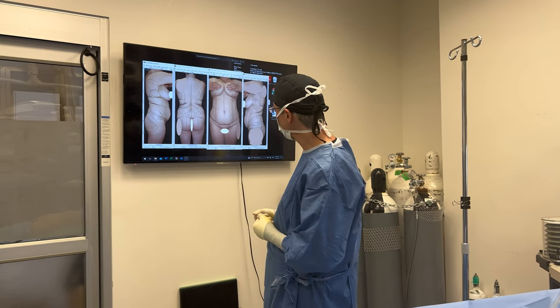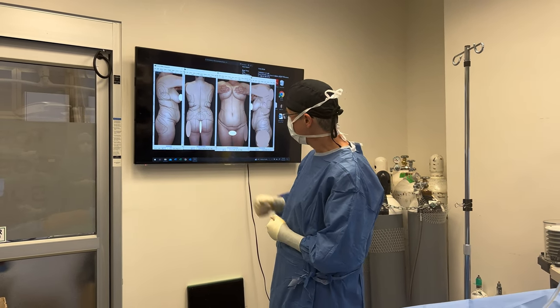Welcome back to the OR. Up next, we're doing a level 360 lipo on the same lady. BMI, I believe, of 26.